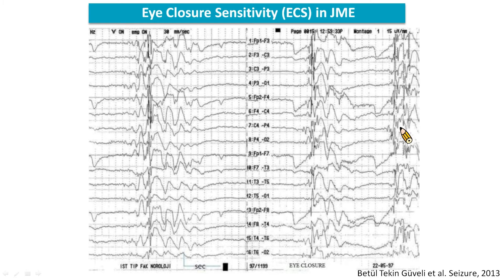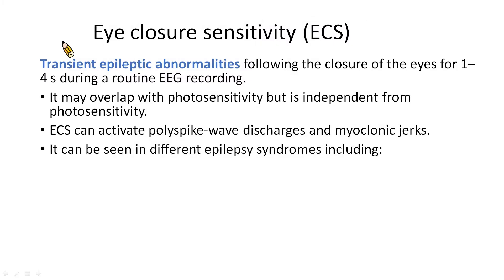This EEG shows generalized multi-spike wave discharges in the resting EEG that appear on more than two occasions after eye closure. This phenomenon is called eye closure sensitivity, which can be observed in JME. I would like to make a special mention about eye closure sensitivity.